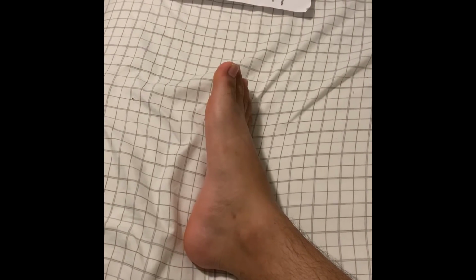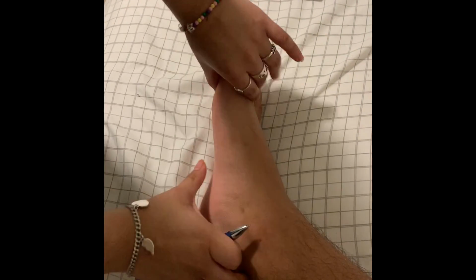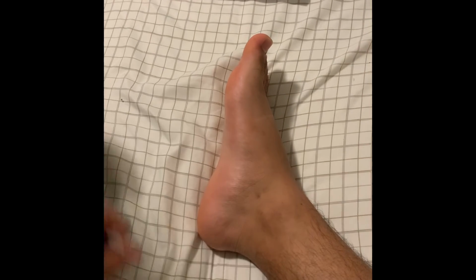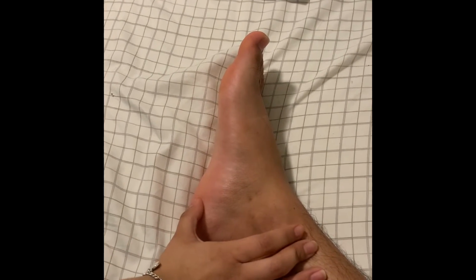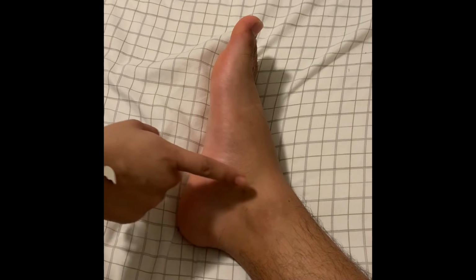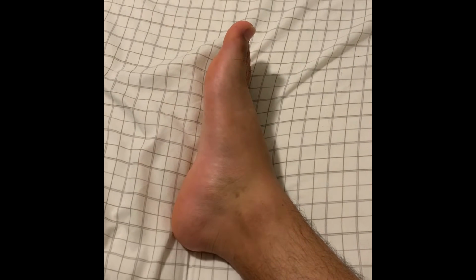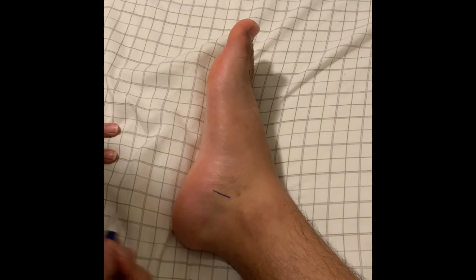Okay, so now we're going to be doing the lateral projection for the right foot, which is like this. Now I have my patient positioned already. And for the lateral position, whenever the central ray hits the foot, you want to make sure that it's right here. So it's going to be right here. And I'm going to go ahead and mark just a little bit so that you can see where it's supposed to be. It's going to be right there.